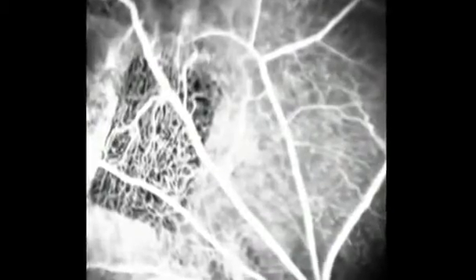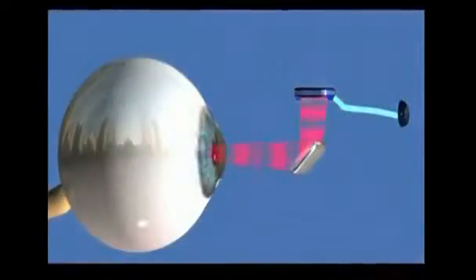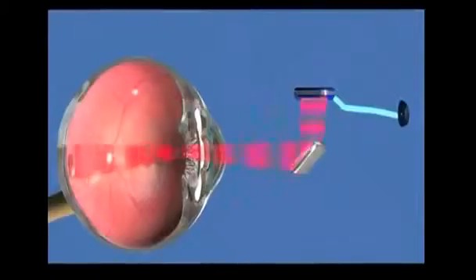Daniel Palanker, an associate professor of ophthalmology, helped design the chip. He says it's the principal component of a system that uses goggles to capture video and convert it into infrared laser light that is transmitted to the tiny chips implanted in the retina. It's like the remote control for a TV: you don't see that there is some light coming out, but the TV set does. That's the same idea, that basically the eye doesn't see this light, but the chip can still absorb these photons and convert them into electrical current.